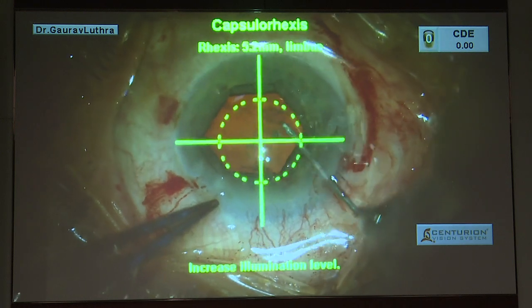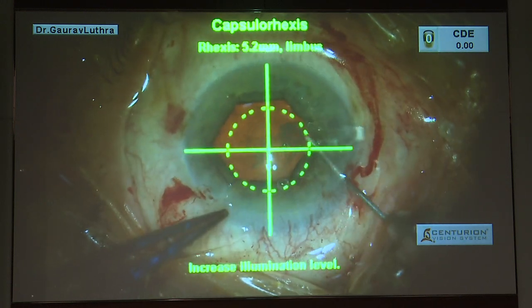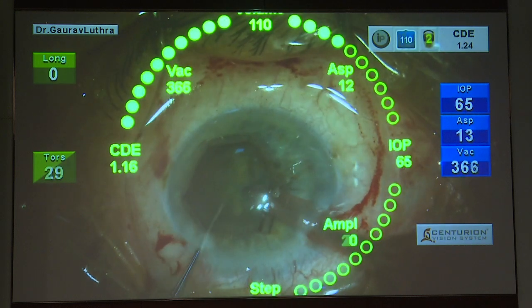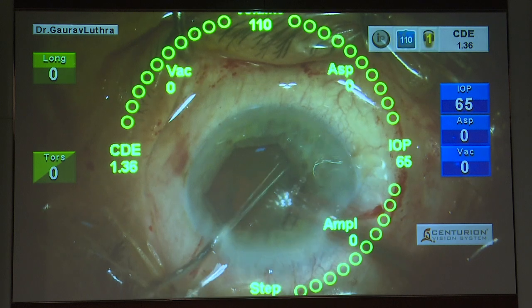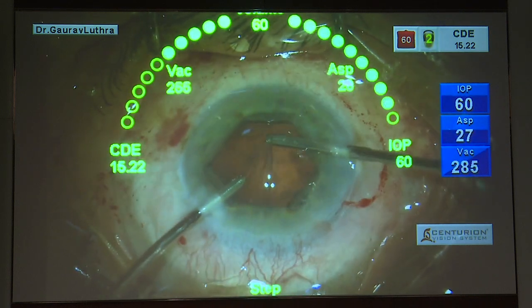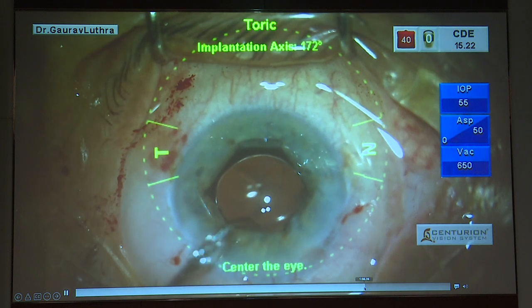I mean, with the Malugins, which I find much easier to use and slightly more challenging to remove from the eye, you can get maybe a slightly bigger pupil size than what you get with the BHEX. So all the same, the price is almost 1/8 or I don't know 1/5, but it works well, and you can then complete your surgery. Bringing it out, as I said, is quite straightforward.